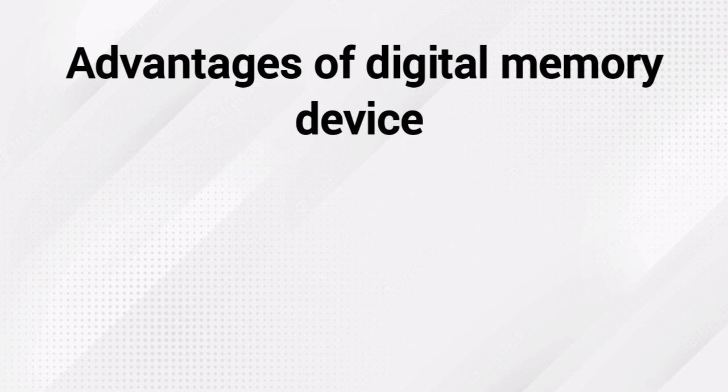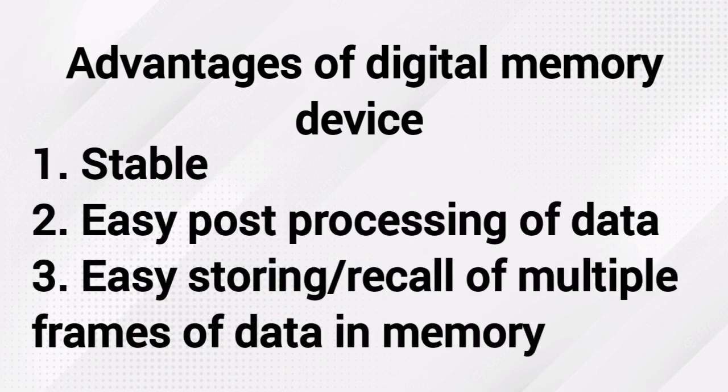Digital memory devices have the following advantages over the older analog scan converter. The data is stable. Once the echo amplitude is converted into a number, it doesn't drift or change. The data can be processed easily simply by manipulating the numerical value of data in the memory. That is the second advantage. And the third advantage is that mass production of RAM chips in recent years has dramatically increased the capacity of digital memories. This permits the modern digital scan converter to store multiple frames of data in memory that can be instantly recalled by the sonologist at the touch of a button.